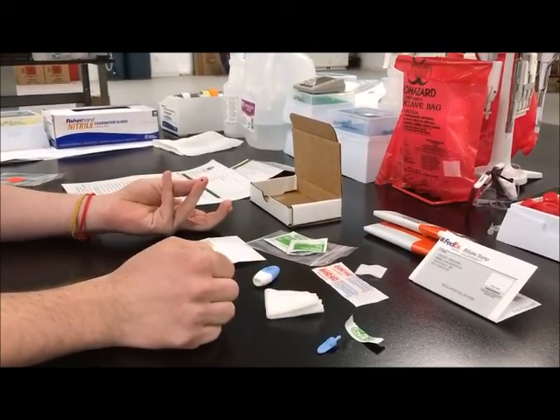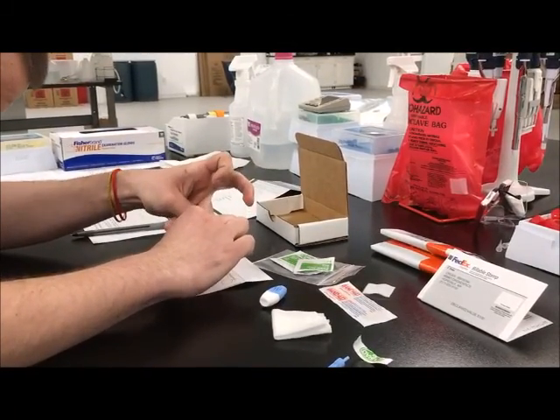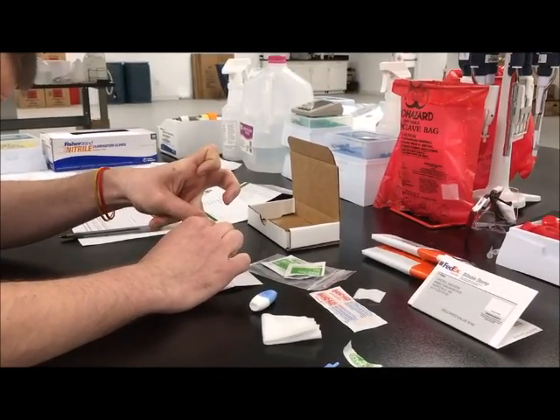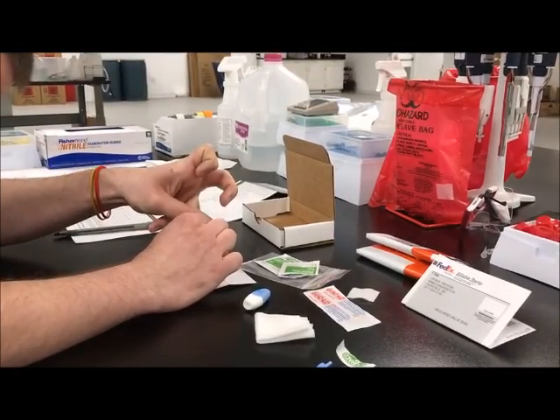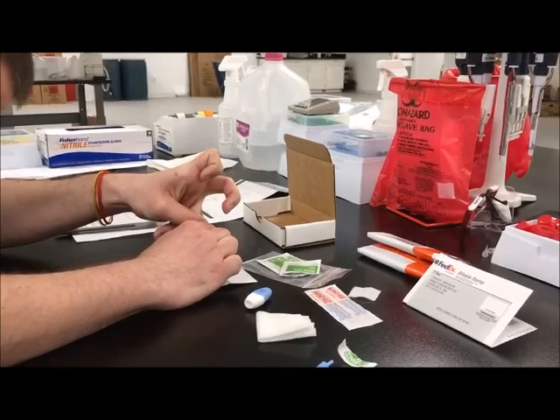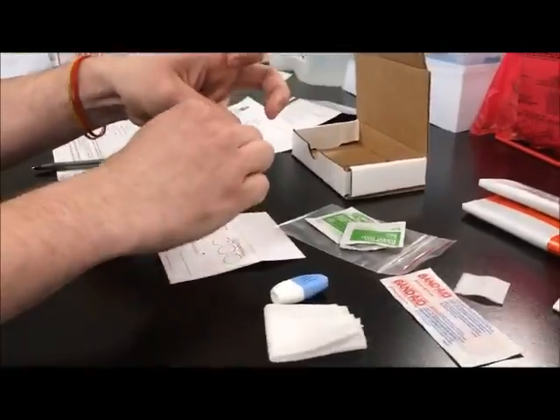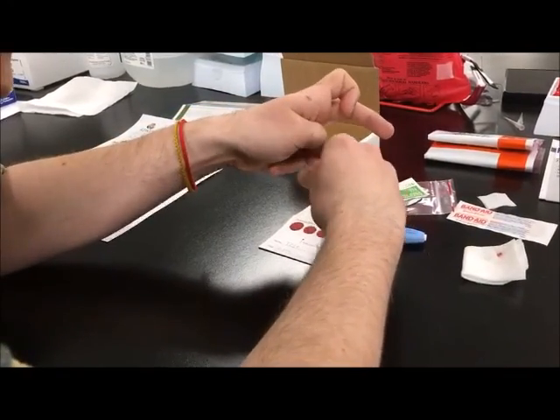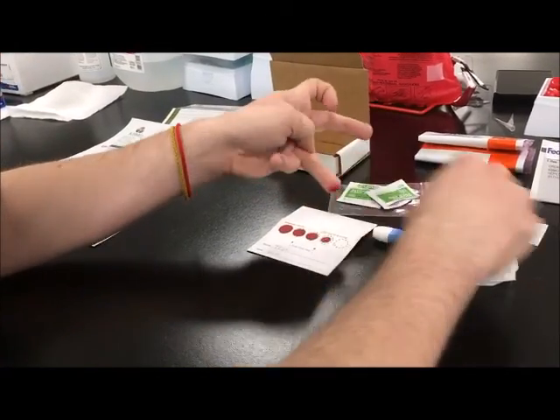Gently massage the finger to produce a large droplet of blood. Apply the blood drop to one circle of the protein saver card. Continue to wipe away the remaining blood, massaging the finger and applying large free-flowing droplets of blood until the remaining circles are filled. Five full circles are required for testing.